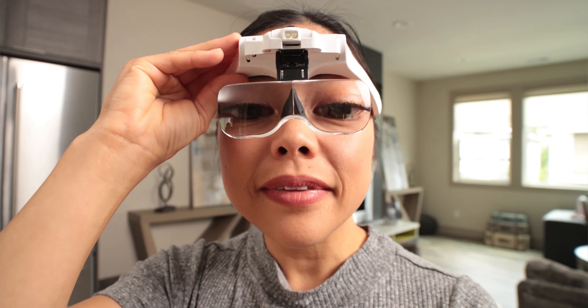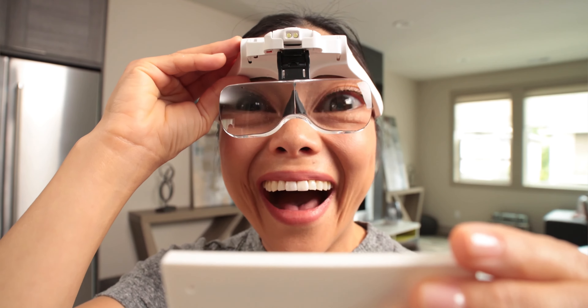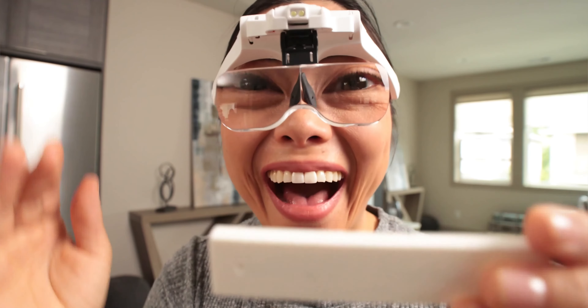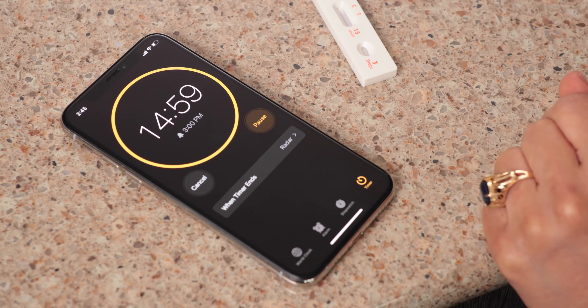After 15 minutes, you can officially read the results of your test. But be aware you only have another 15 minutes to read them before the results are officially considered invalid. It's a good idea to set another timer.